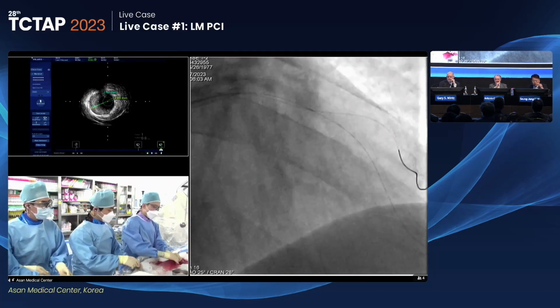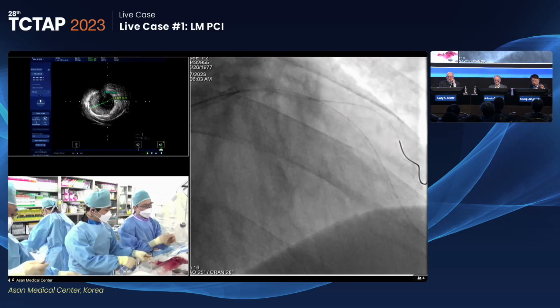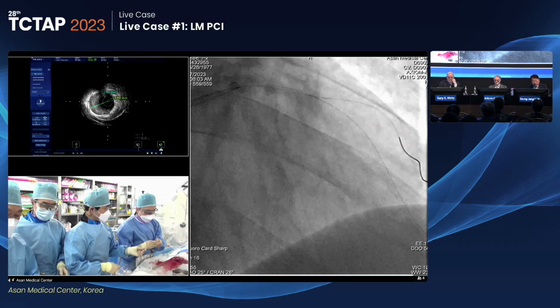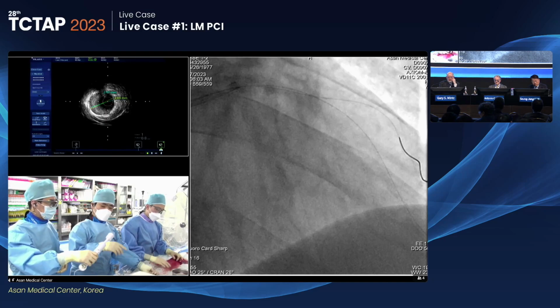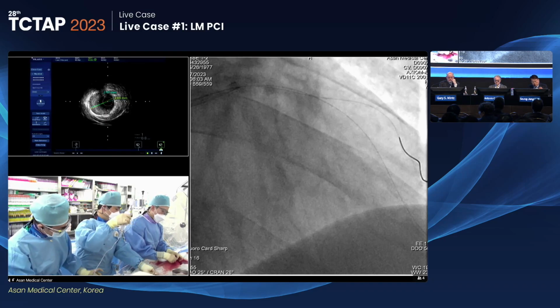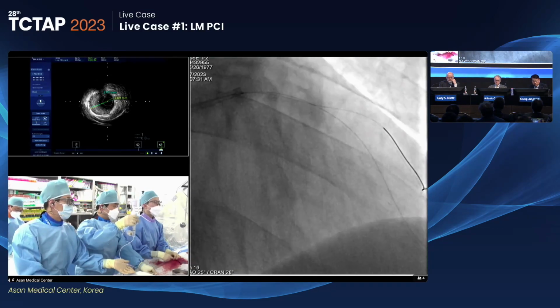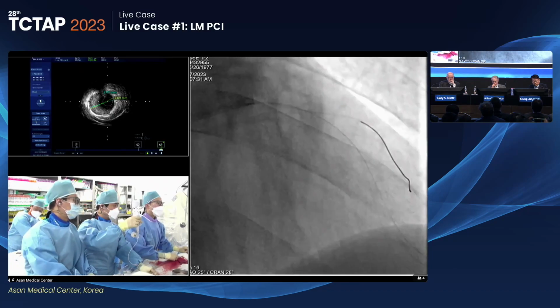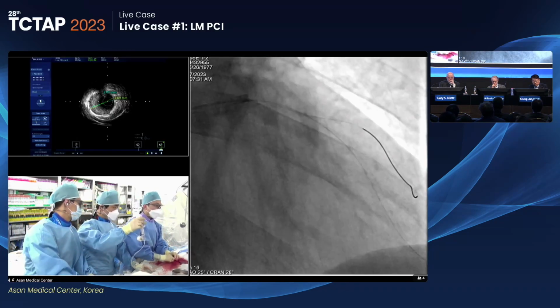Let's see how. All right, just the diagonal stent first. Yeah, and no another balloon before then. And just stent. Stent alone, yeah. Yeah, just pass the stent alone. Diagonal first. And really more strong impact of guiders inside. Why not? We're going to try that first. Good. Not too much. Anyway, yeah, not try too much. That one.